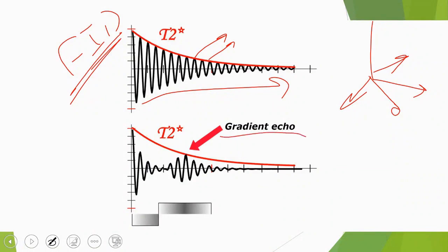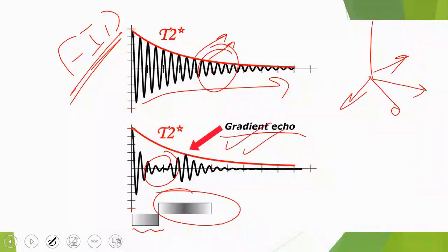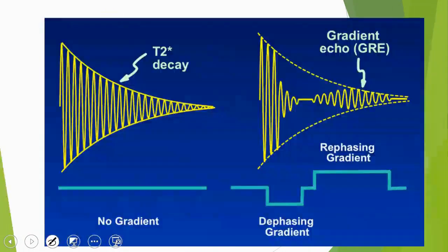In the gradient, what exactly do you want to do? You definitely want to strengthen the signal here because it has weakened significantly. So you use what works best, and then you use whatever is available to start capturing your signal effectively.